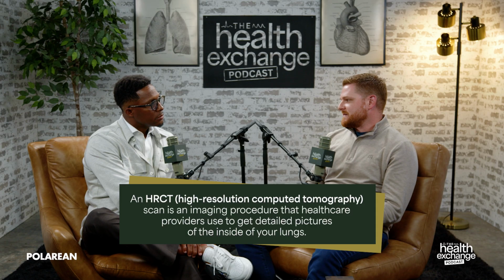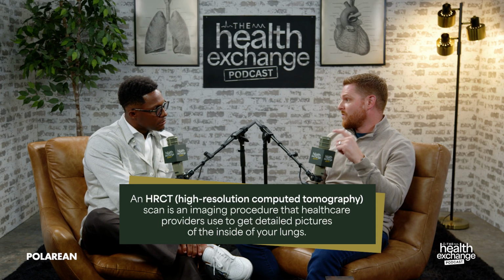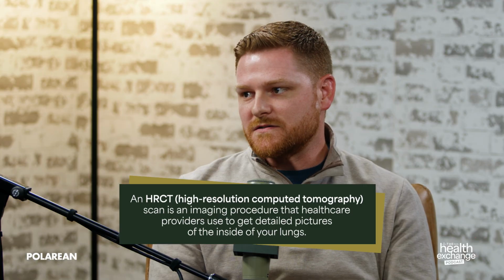And then HRCT scans basically turn that into thinner slices, but they still may skip portions of the lung, which is okay if you need a few high resolution CT slices to see what the pattern is of the lung disease. But it's not good if you have a nodule or something there, right? You could easily skip over it.